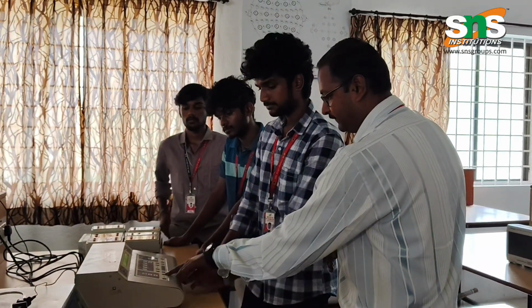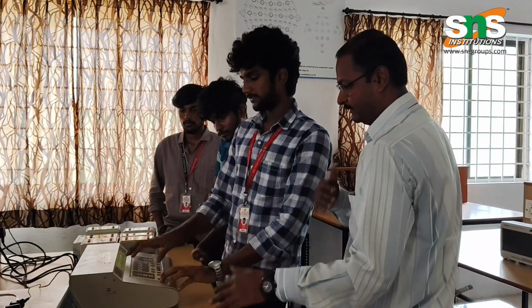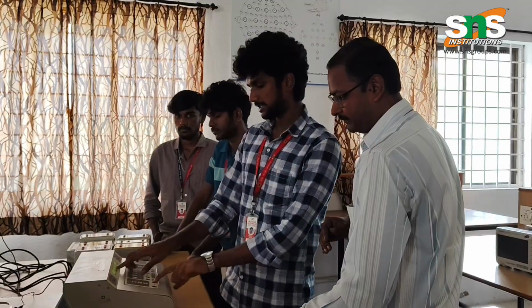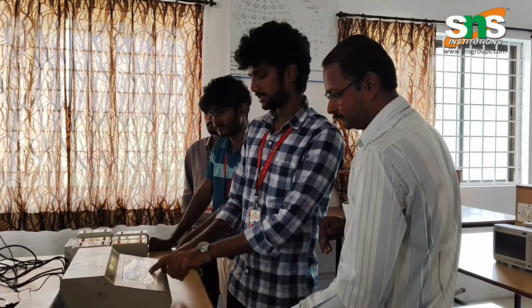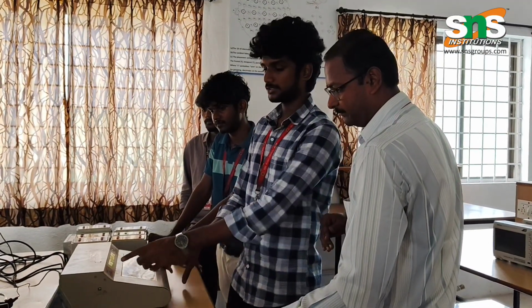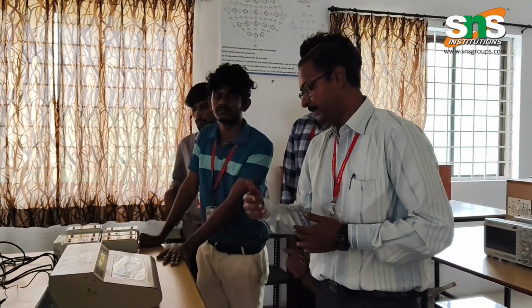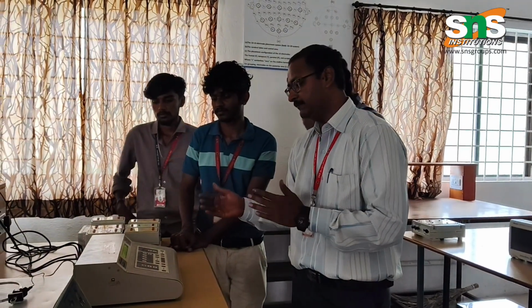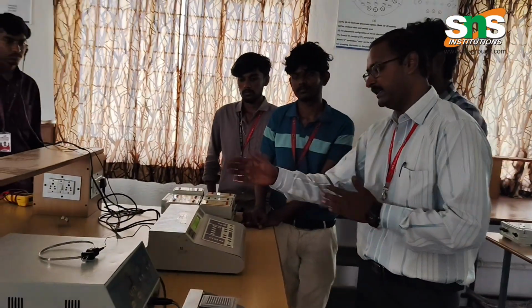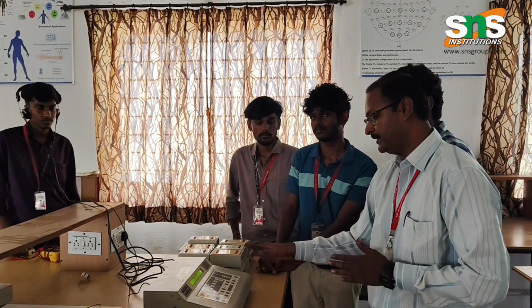Then try to increase the frequency and the stimulus, and identify what changes the machine goes through. As of now, I have increased the frequency. The frequency ranges move from 1000 to 2000. So I can increase the frequencies and give the stimulation, so the patients can hear the audio from their earphones. Like this, we have to repeatedly measure for various decibel values and various frequencies to understand whether the patient has any trouble hearing the normal frequency range, that is 20 Hz to 20,000 Hz.